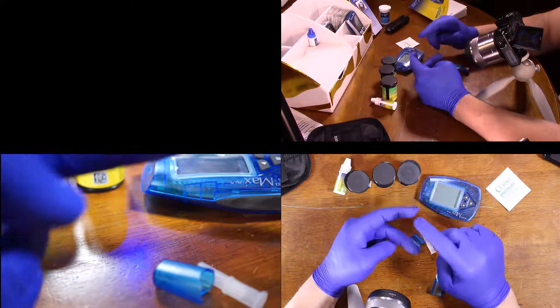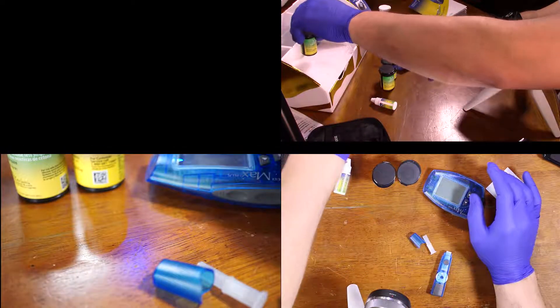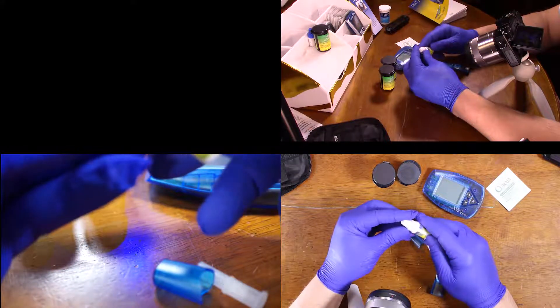Let's go ahead and do a glucose test first on that finger, and then maybe the ketone on that finger. Let's put this ketone bottle away. I think we should do a test — test the machine.